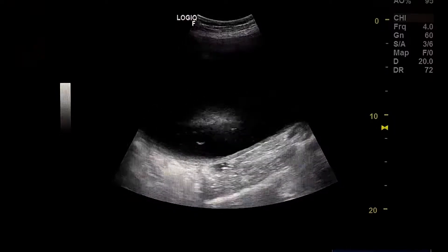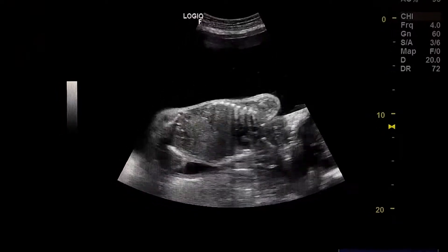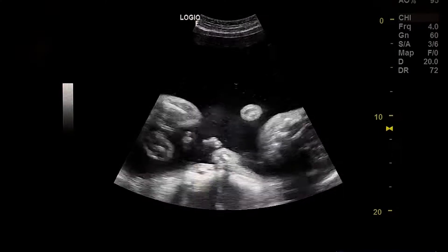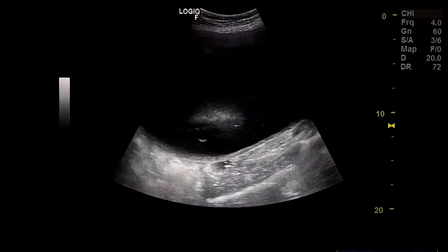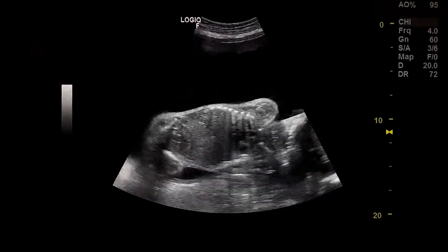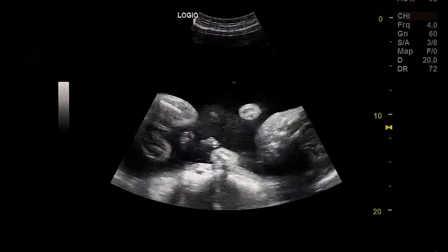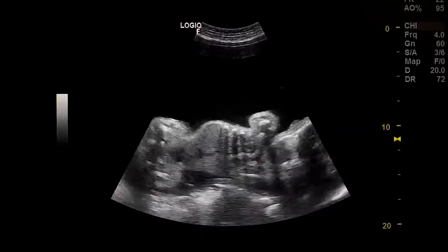Pregnant female, 40 years old. The fetus is 31 weeks with polyhydramnios. This is an anomaly scan.